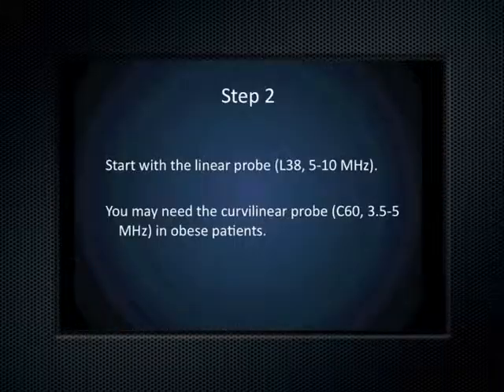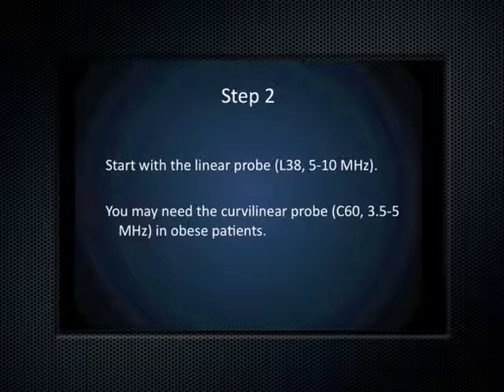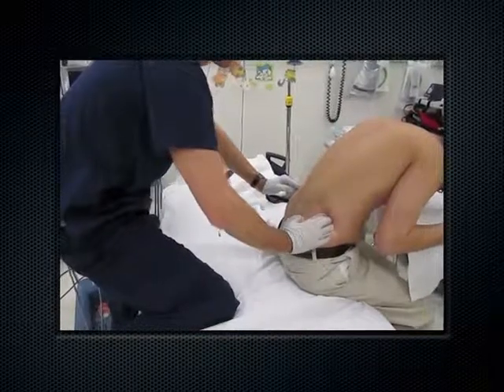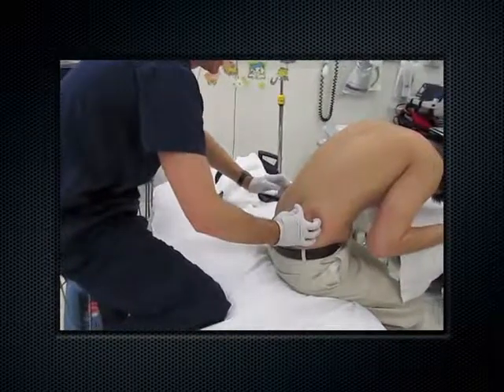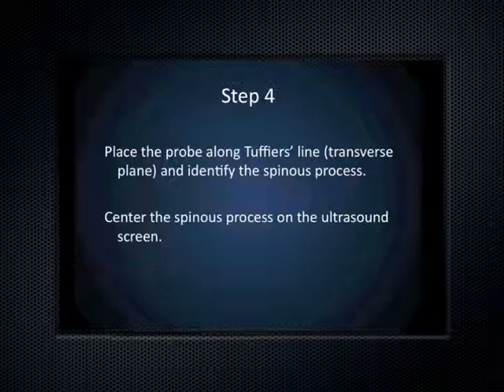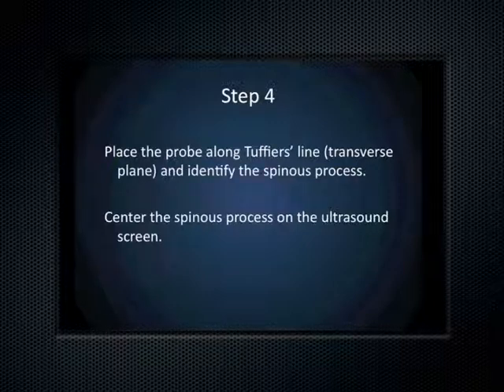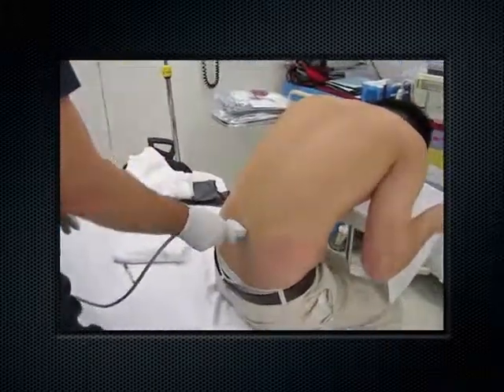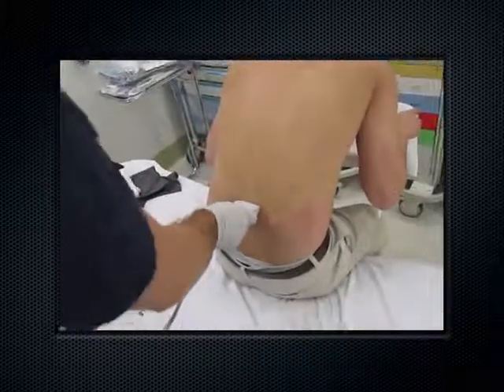Start with the linear probe or the L38. In a more obese patient you may need to move to the curvilinear probe. Identify Tuffier's line — the horizontal line between the superior iliac crests — which helps you identify where to first place the probe. Place the ultrasound probe along Tuffier's line in the transverse plane, keeping the probe marker to your left and to the patient's left. Then find the spinous process and center it in the middle of the screen.